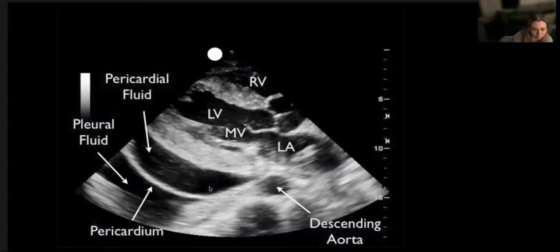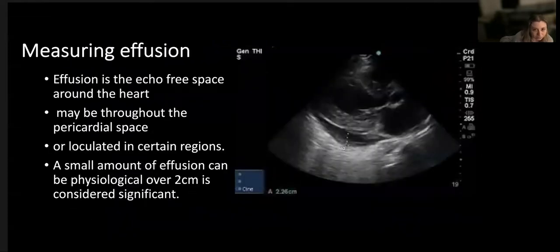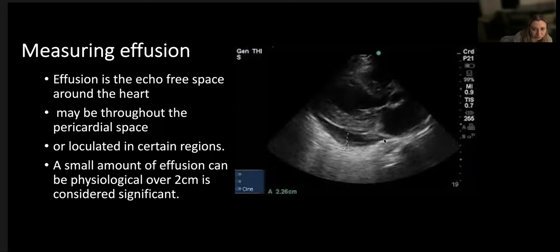Here again we've got both - a pericardial and a pleural effusion. The pericardial fluid is a little more, so it's pushed that pleural fluid away from the descending aorta. When measuring the effusion, it will collect in different areas. Generally measure at the widest point, describe where it is, and measure perpendicularly across. Comment on whether it's loculated or whether there are fibrin strands. Anything over two centimeters is more significant, but it depends on how quickly it collects.